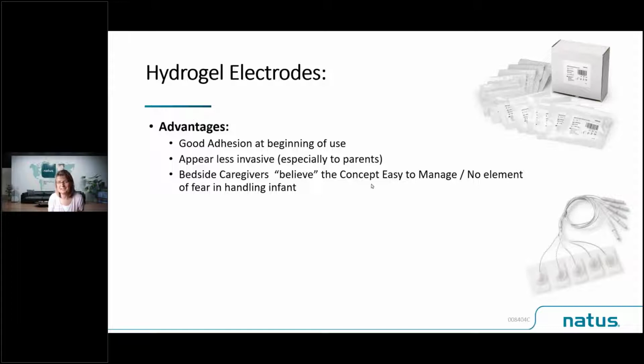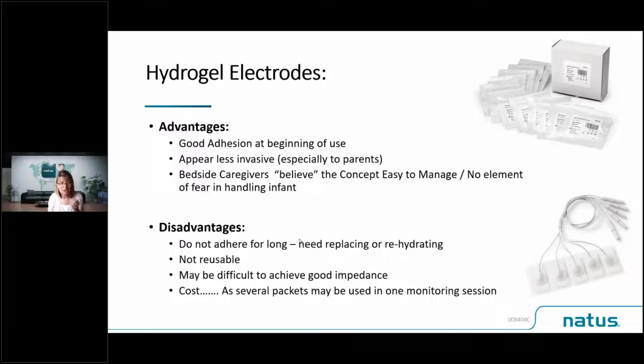However, the disadvantages are, as I mentioned earlier, they don't stick forever. They sometimes don't adhere for long, and they may need either rehydrating, dropping some water underneath, or replacing during the monitoring phase. They are single patient use electrodes, so they're not reusable.